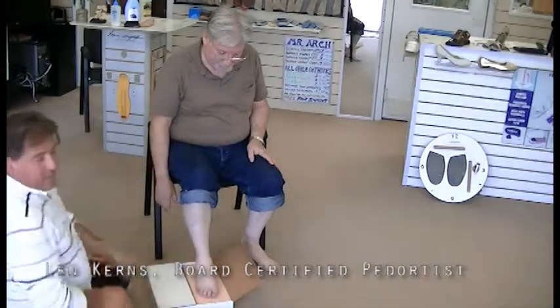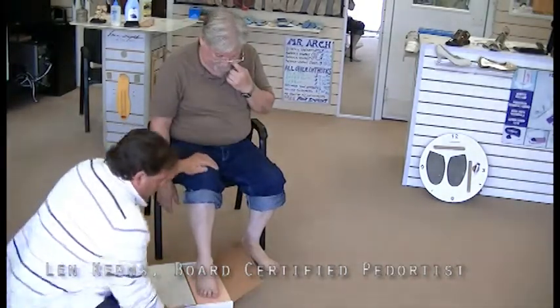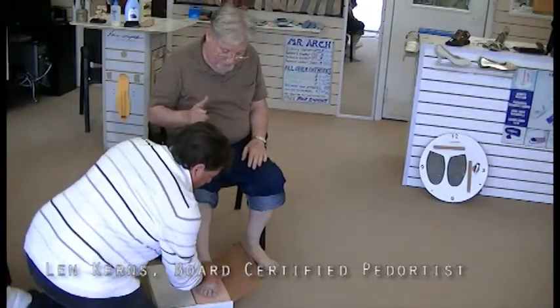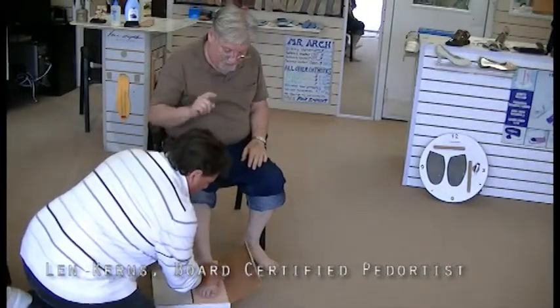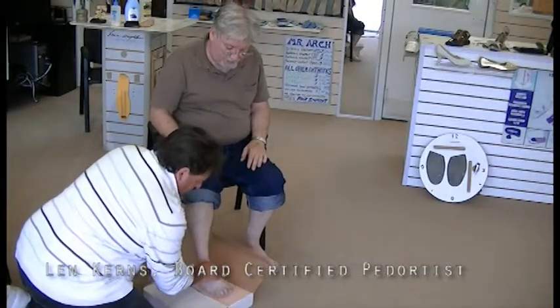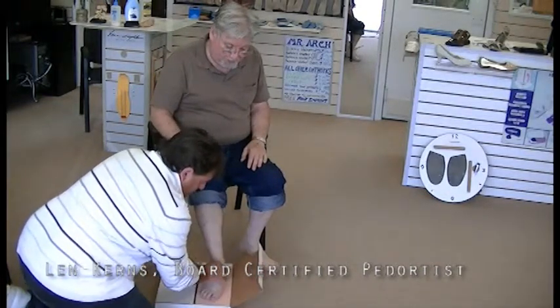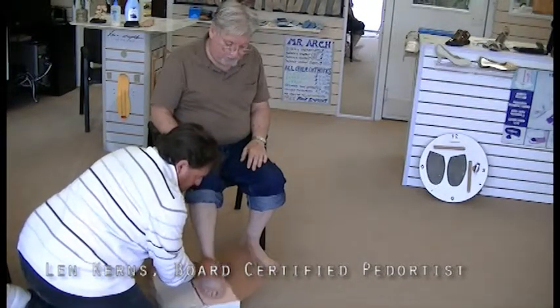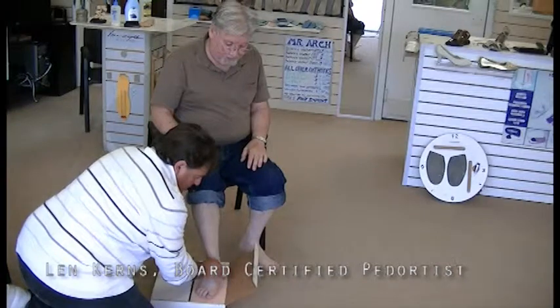The foot is gently placed on the foam, and we're just going to demonstrate one more time. He's holding the knee 90 degrees, but usually he's in front. So now this time it changes. The index finger is on that navicular and talus joint. And as you can see, he's supinating me, he's pronating me, and now he's going to find subtalar neutral. And before you cast again, I would like you to demonstrate.